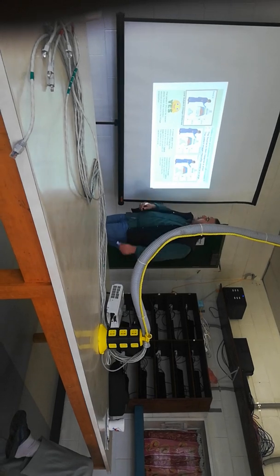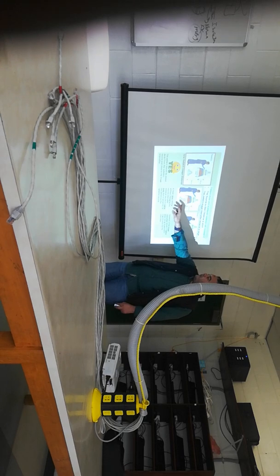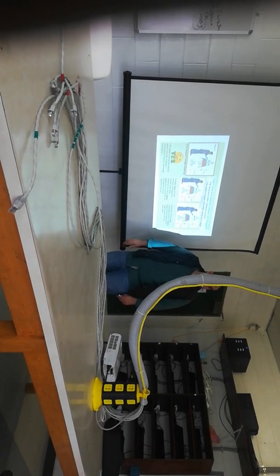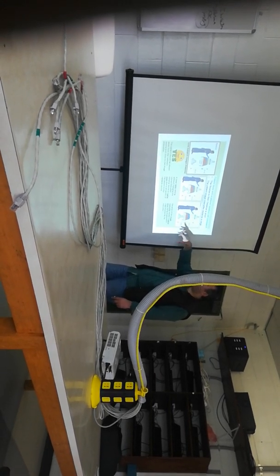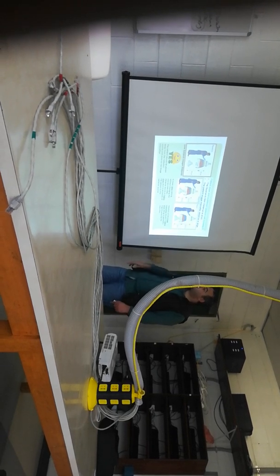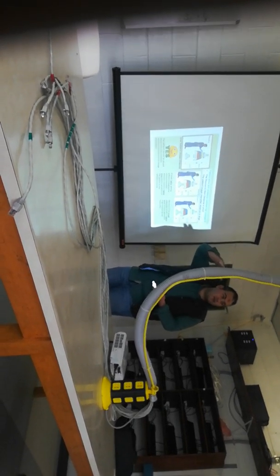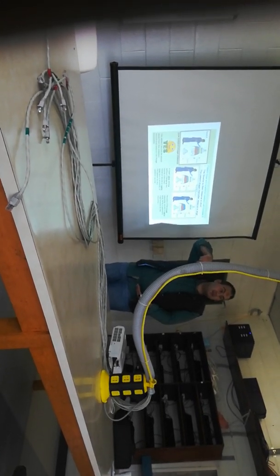But if we decrease the distance between the X-ray tube and the table, with the same distance from the table to the image intensifier, the dose becomes 1.4 dose units. When I increase the distance between the table and the image intensifier, the dose is 2.6 dose units. So you have to put the table at a great distance from the X-ray tube to protect yourself and to protect your patient.